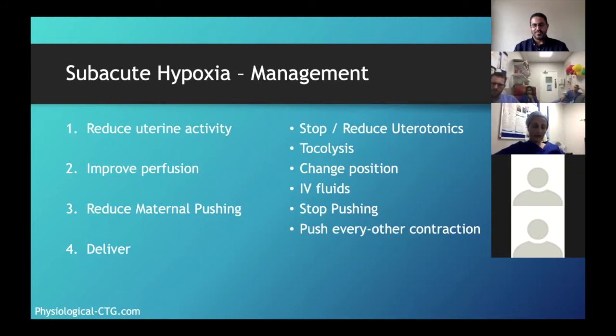Do you agree? So that was going to be my next question, but yes, that's fine. Do you agree, guys? Because I'll tell you, we have introduced STAN. I did convince the trust to invest £300,000, and we have not shown any decrease in cesarean sections or instrumental deliveries for suspected fetal distress.